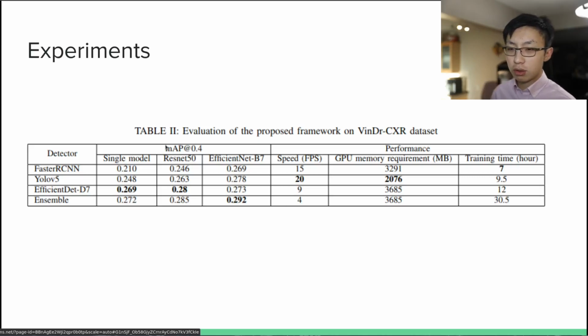Inference time is also a crucial metric in high-volume cases. For example, a hospital adopting a new computer vision technology on an existing massive database of chest x-rays, or perhaps in times of great need and emergency, say during COVID-19.